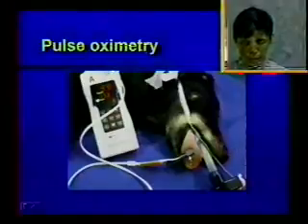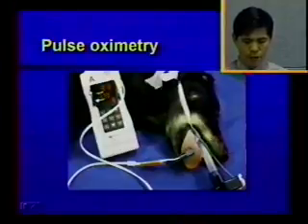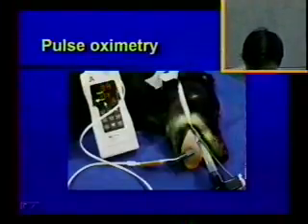As you could see here, there's a probe that is on the tongue of the animal. And 99 here is what we call SpO2, that is the saturation. And it also provides you heart rate. As you could see here, the heart rate is 173.